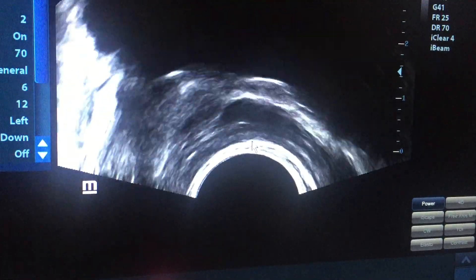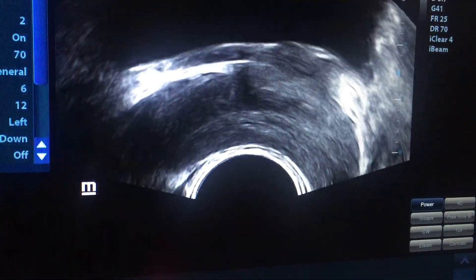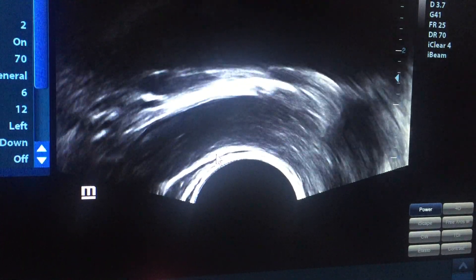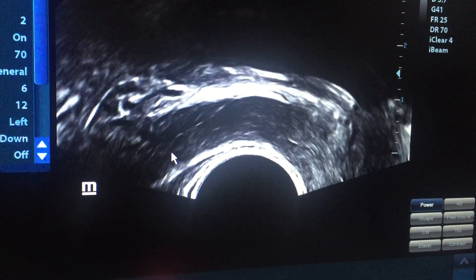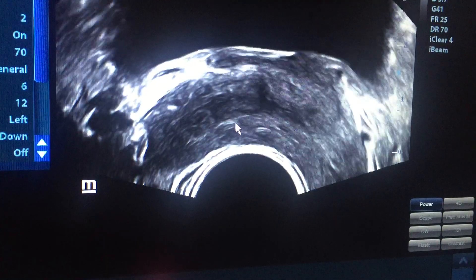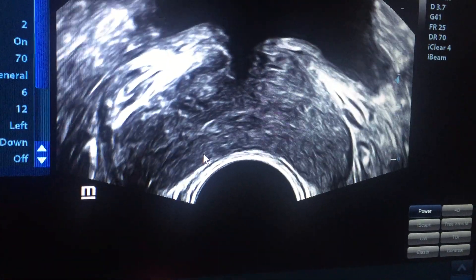This is the left side. We can do the same on the right side. This is the right side — here is the area of the seminal vesicle — and there is no obstruction, no stones, and no dilatation of the duct itself.